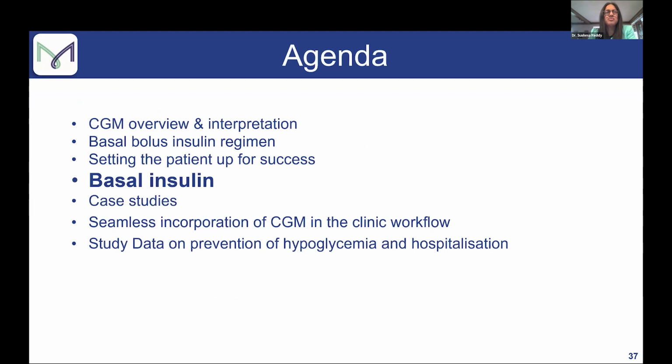I would comment that with where you are, having worked with Laura, I know some of your patient profiles. And so you could also have, depending on what food they have available to them, something like: when you have the cereal available to you, here's what insulin you take. But when it's not available to you, here's what you take. And you could then have different options. If you've had them wear a CGM once and track some of their food, you now know what to tell them for their insulin dosing.